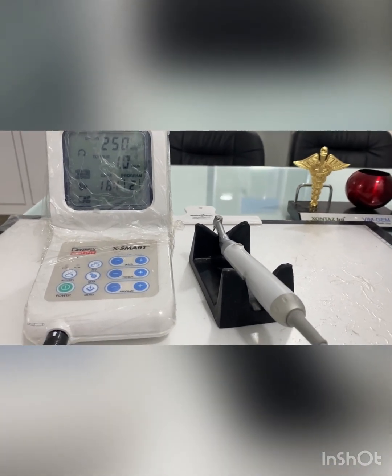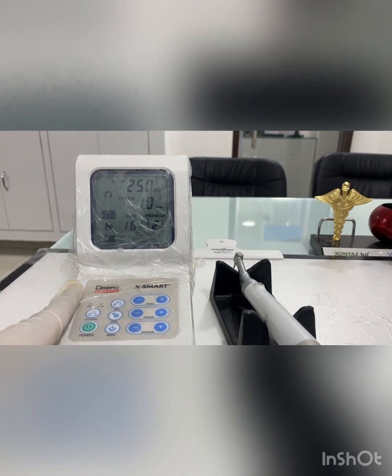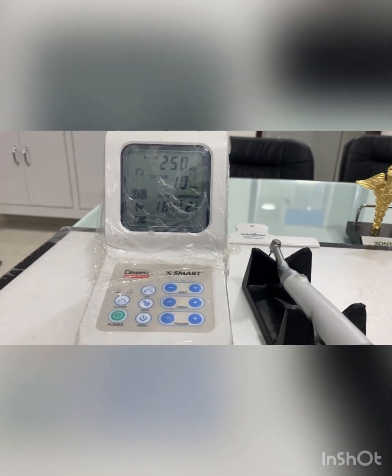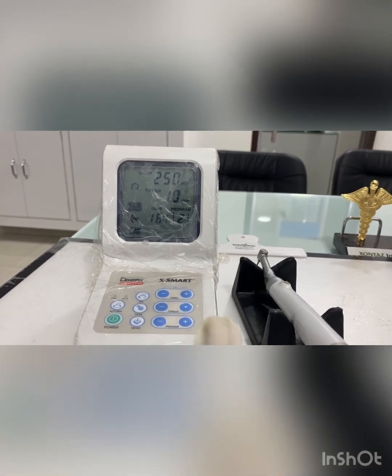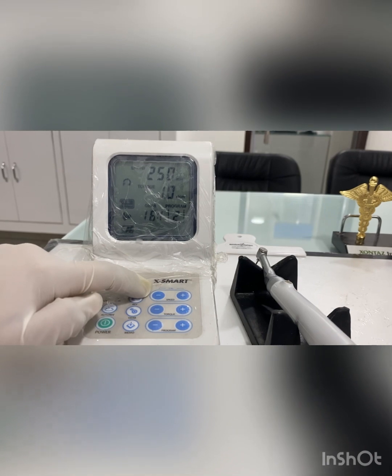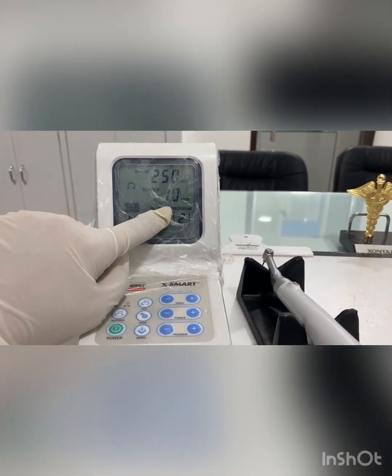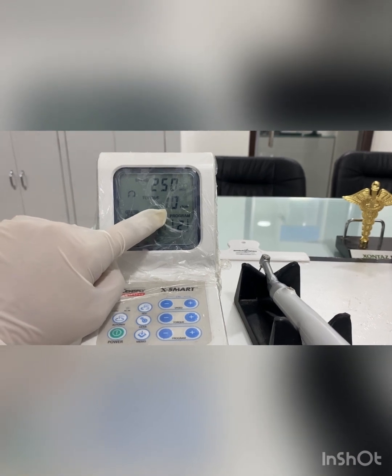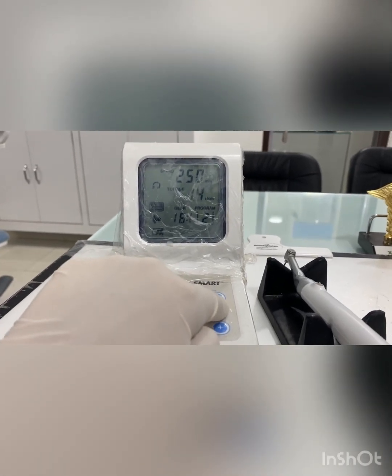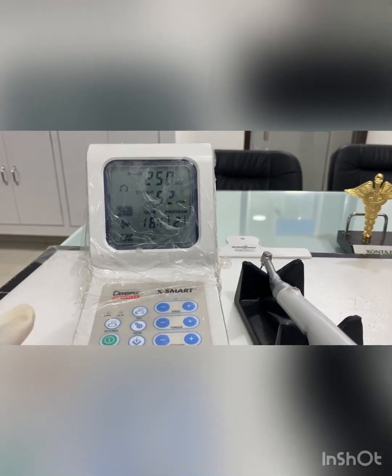Torque is the force with which the file moves within the canal — it is the driving force of the file. You can keep your torque low or high. In this endomotor, speed ranges from 120 to 800 RPM, and torque ranges from 0.6 to 5.2 Newton centimeters. You can adjust both speed and torque according to the file system you are using.